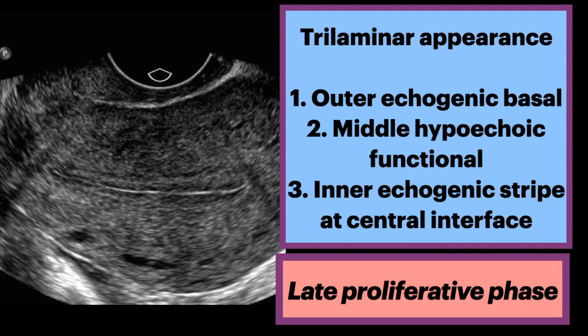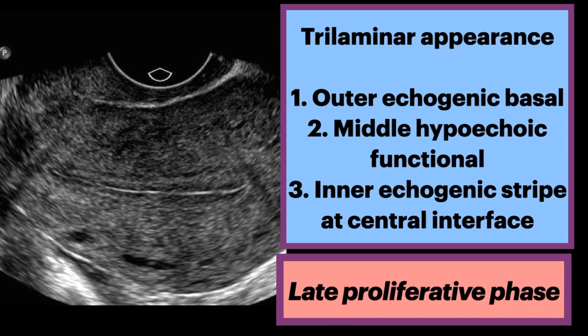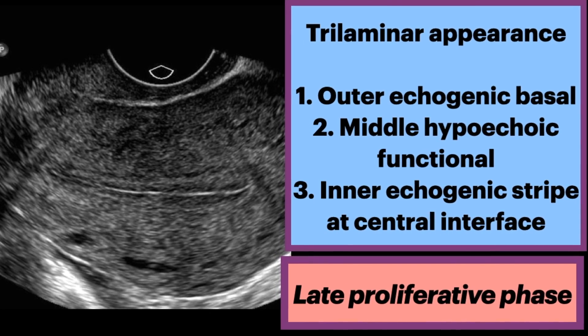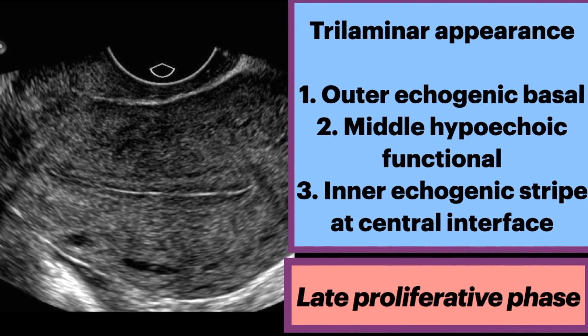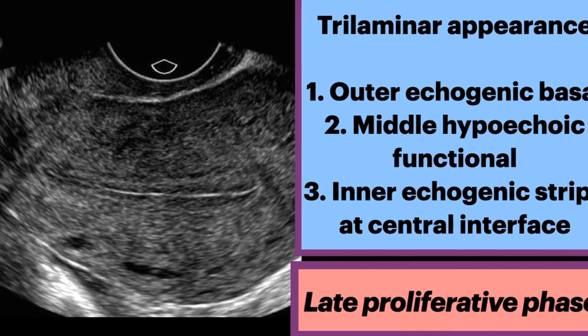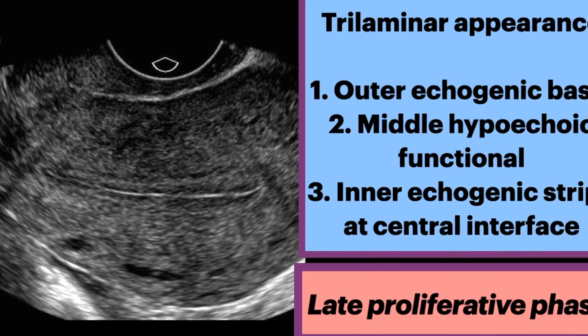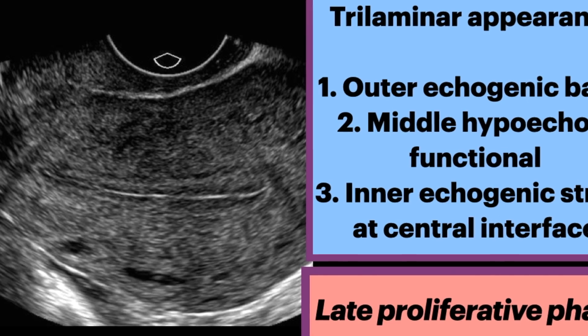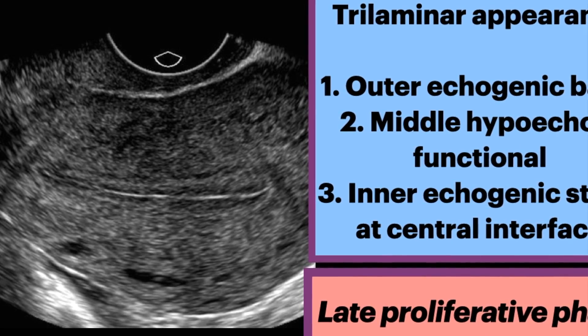In the late proliferative phase, there is a trilaminar appearance: the outer echogenic basal layer, middle hypoechoic functional layer, and an inner echogenic stripe at the central interface. Here is a typical trilaminar appearance of the endometrium in the proliferative phase. The uterus is incidentally retroverted, and during this stage, there is no corpus luteum.